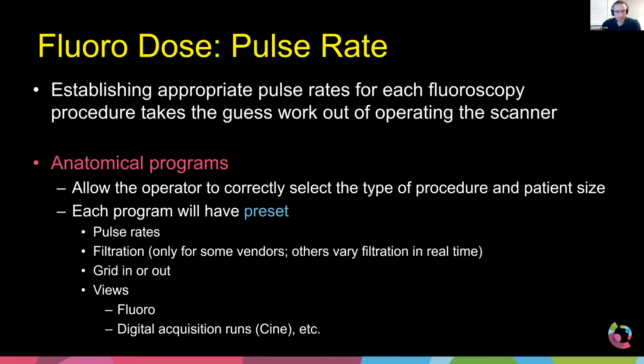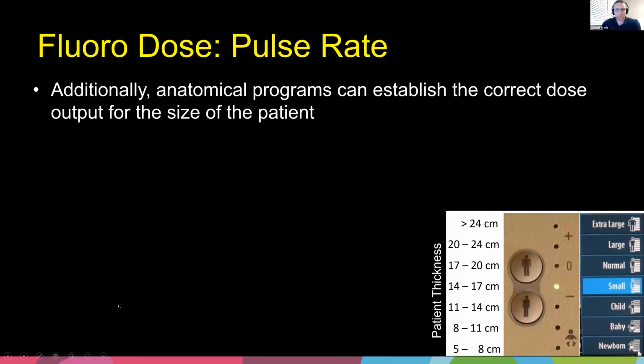So, how many fluoro units should you have? Digital angiograph, digital images, cine runs, DSAs. You need to work all that out.